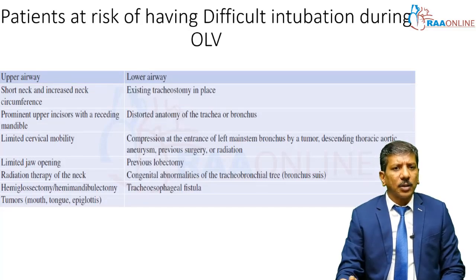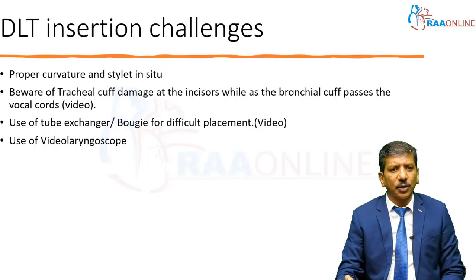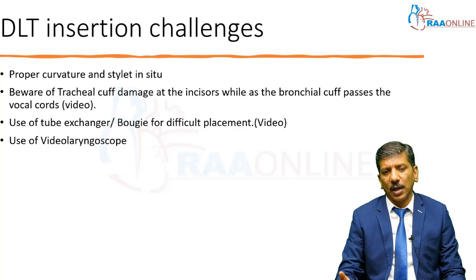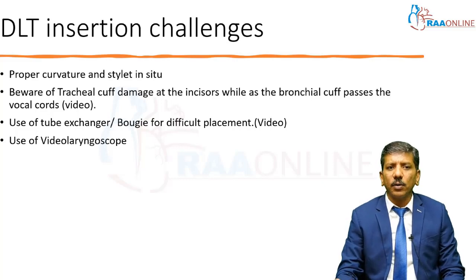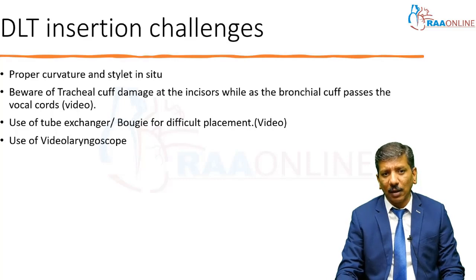When you put a DLT, sometimes if you don't take precaution, you may land up in trouble, like proper curvature of the DLT. Let me show in the next slides how to do a proper curvature and also proper stiletting of the tube. And also when you do intubation with the DLT, the bronchial cuff will pass the vocal cords, but you should be aware that the tracheal cuff has still not gone in and is at the level of the teeth, and if you manipulate the bronchial cuff up and down, it can cause tracheal cuff injury at the level of the teeth. I will show a video after this.